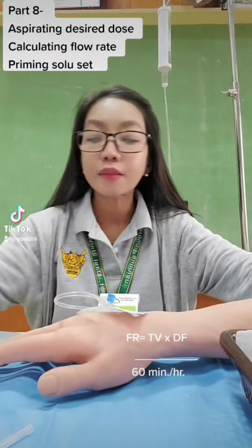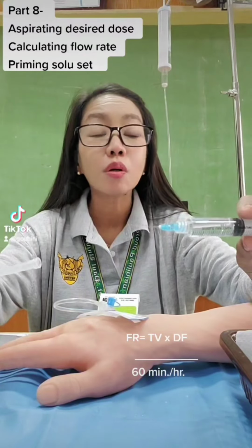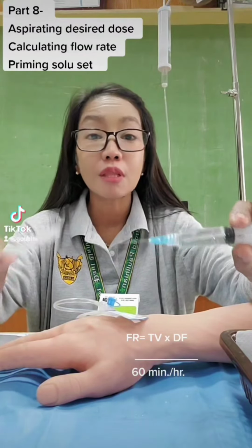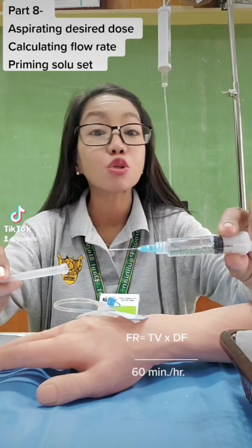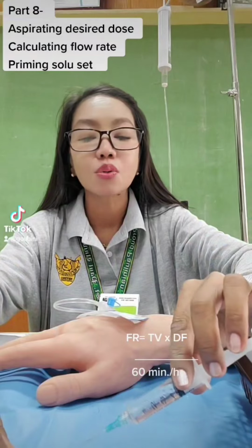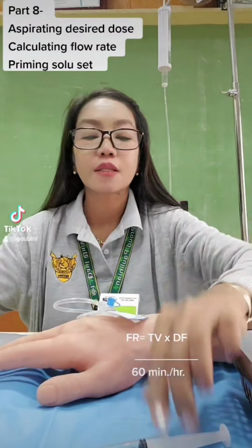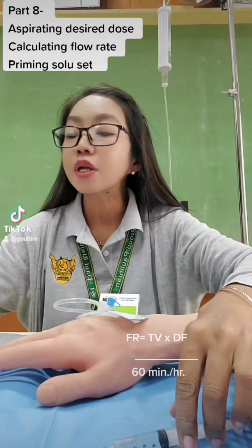So set aside, and then you are ready to reconstitute this in a 50 cc soluset. Scooping again. Alright, so that's it. Set aside your medication.